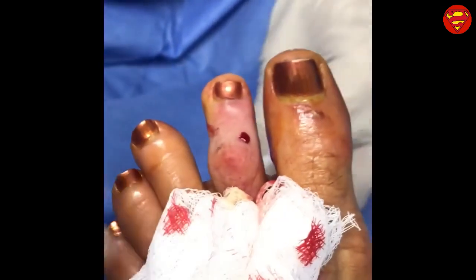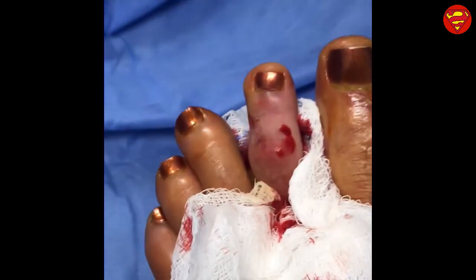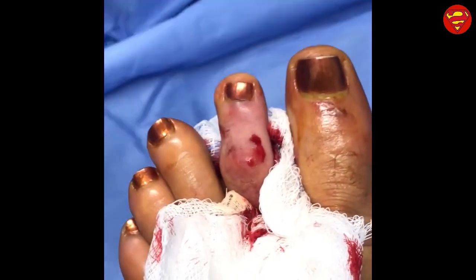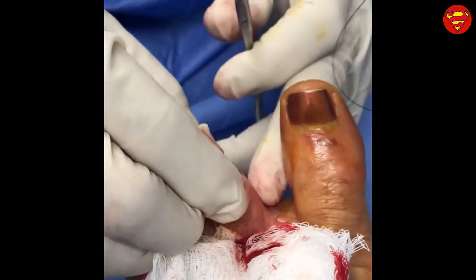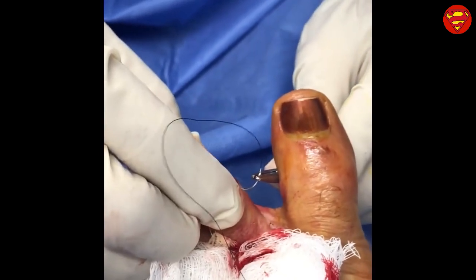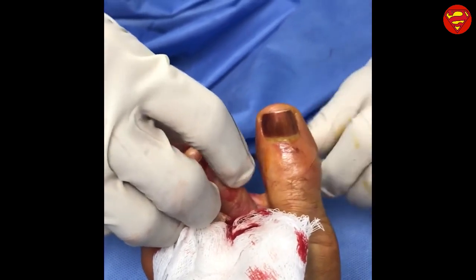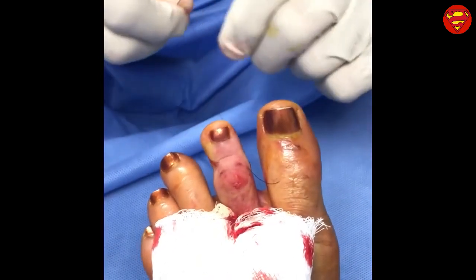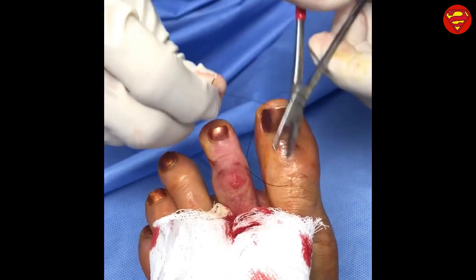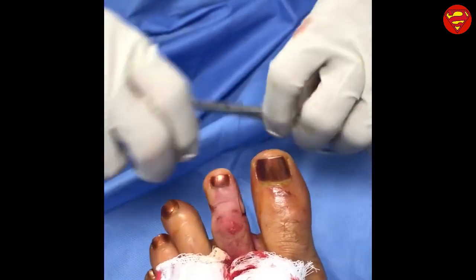So when we talk about beauty and function, the toe we have realigned. I'm going to put one stitch right here. We're just going to put one tiny little stitch underneath. Okay. When we talk about correction of structural deformities, yes, we're correcting the problem. That's the function. And then we're also correcting the aesthetics. That's the beauty.